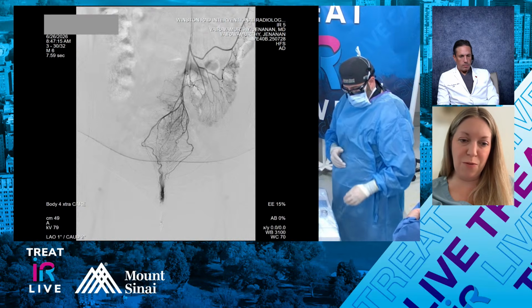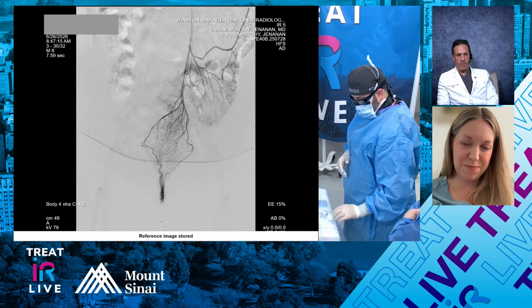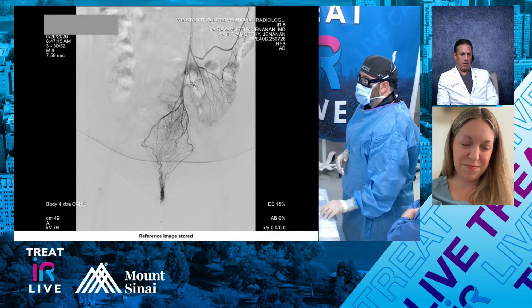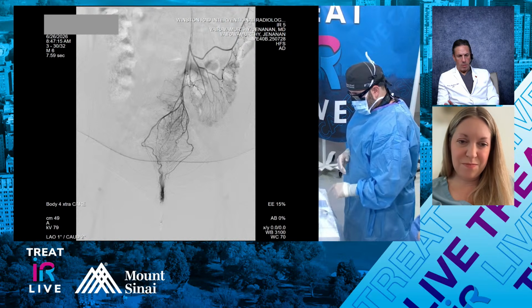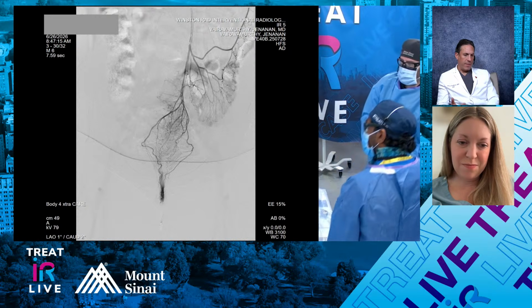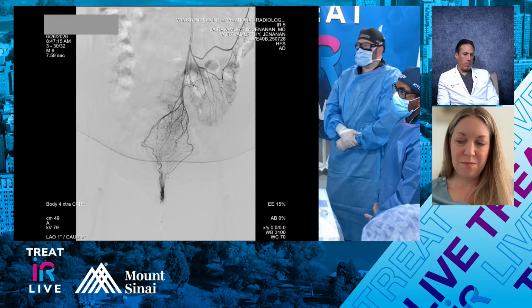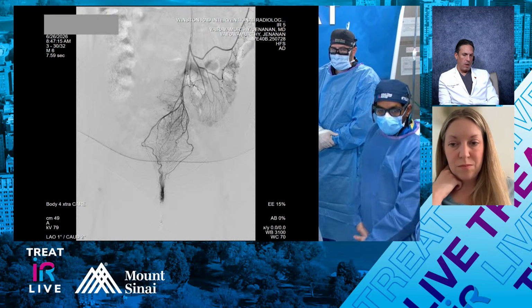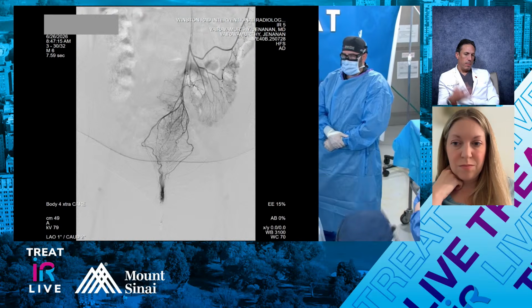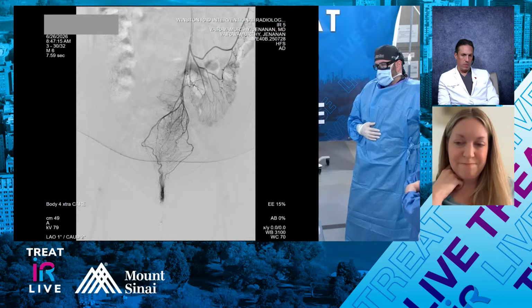I think that's an incredible blush there. By the way, this is a beautiful classic look here. I don't know that I see that very often, but I guess this is a younger patient, so the circulation is excellent. But going back to what I was saying about the liquid, I think we would have to think about where we wanted it to end up and design it that way. There are obviously lots of aqueous-based materials that exist or are being studied now, but we have to think about maybe customizing them specifically for this procedure.